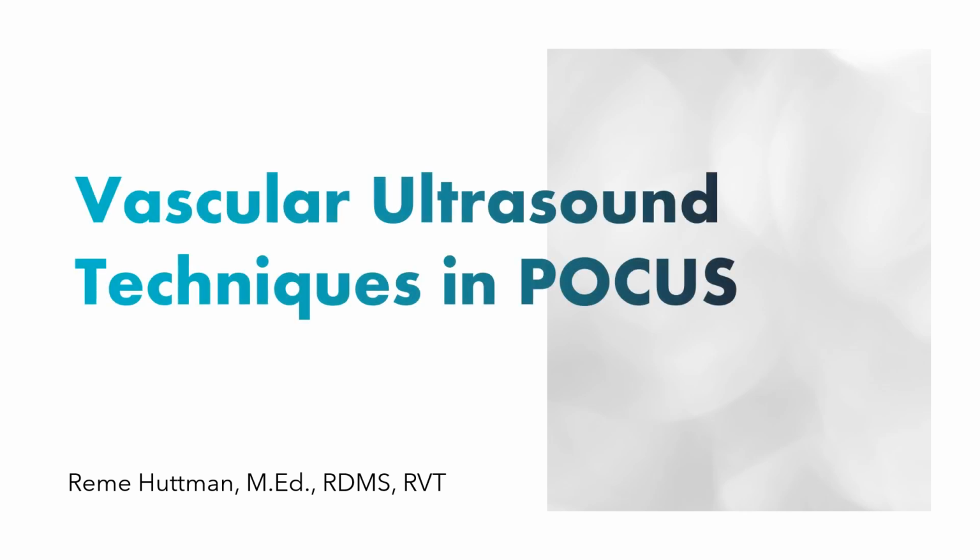Hello, and thank you for joining us for our second lecture for vascular ultrasound for the point of care provider. We're going to look at specific techniques in point of care ultrasound today so that you can utilize those and jump right into your scanning with some confidence that you're doing everything you can to identify any abnormalities that exist.